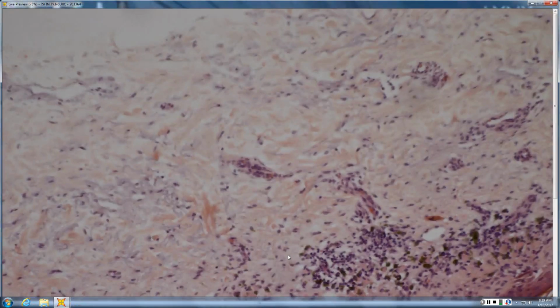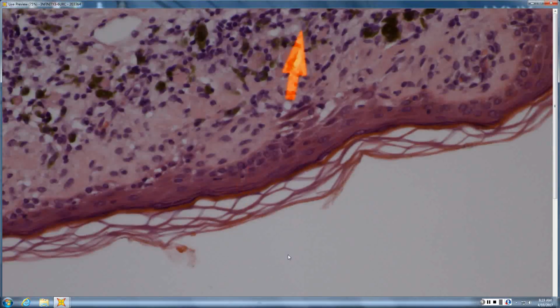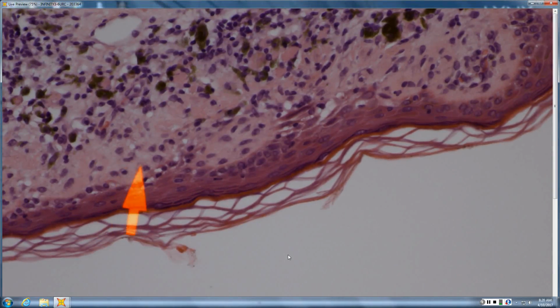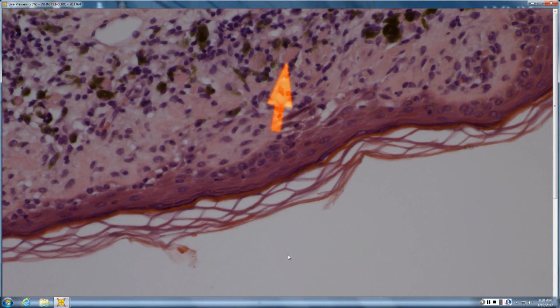No shave. Looks like there's some pigment superficially. So I'm trying to tell if this is pigment incontinence. Yeah, it looks more like pigment incontinence, I think. Tell me about your epidermis. It's pretty atrophic. It's been kind of chewed on, so it could be kind of a burnt out, but there's been lichenoid. Yeah, so it's a burnt out, almost flattened, but still sawtoothed. You've lost your basal layer. They're vacuoles, but they're all in squamous cells, not within basal cells. And you've got these pink globs surrounded by pigment. Some Civatte bodies.